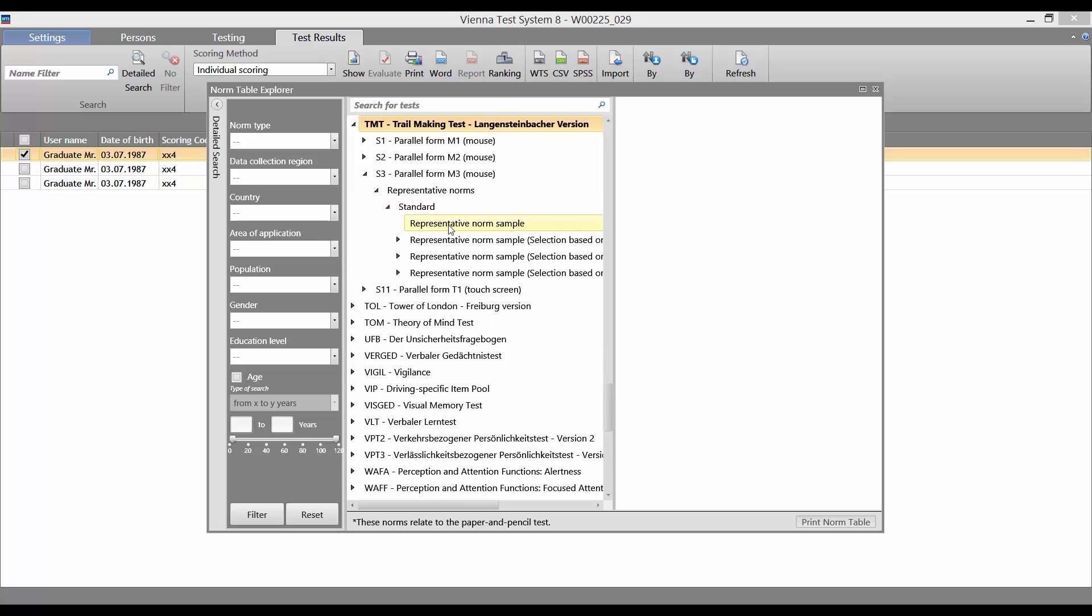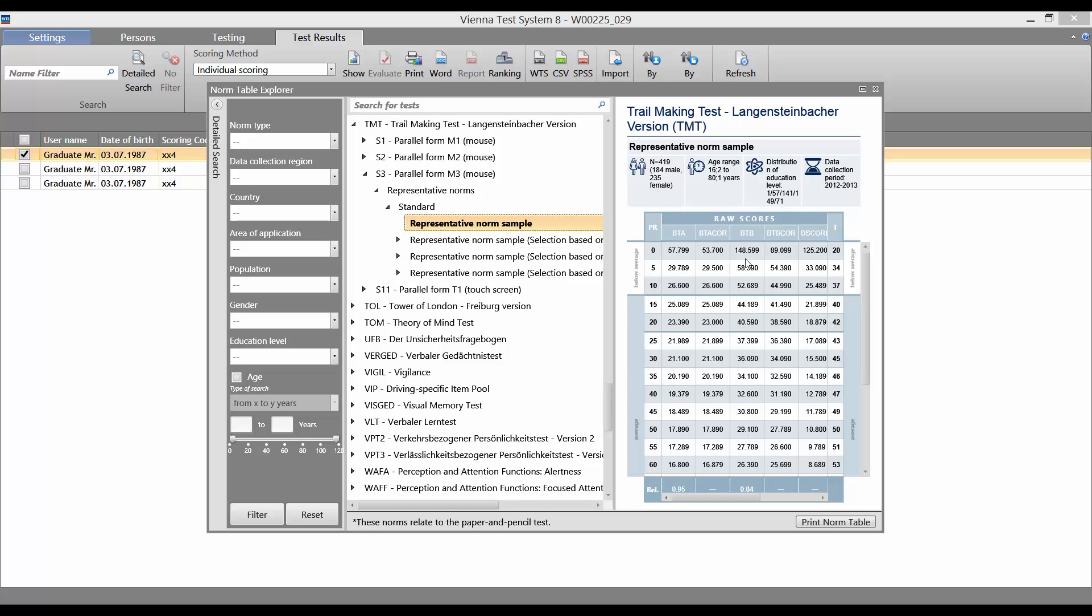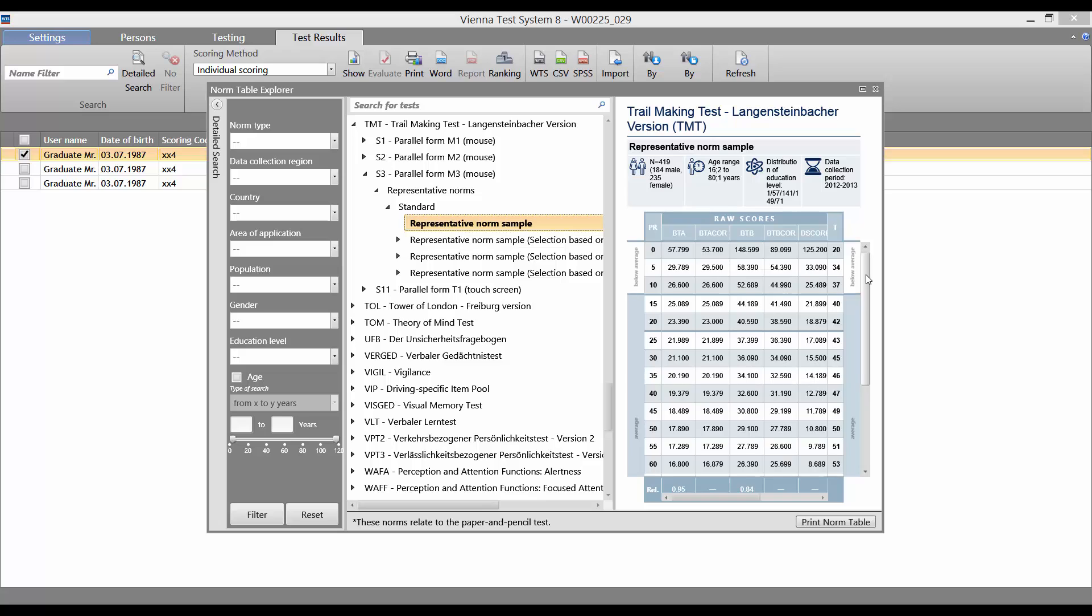Here, we select the required norm sample, and on the right here, we can then look at the Norm Tables in detail.